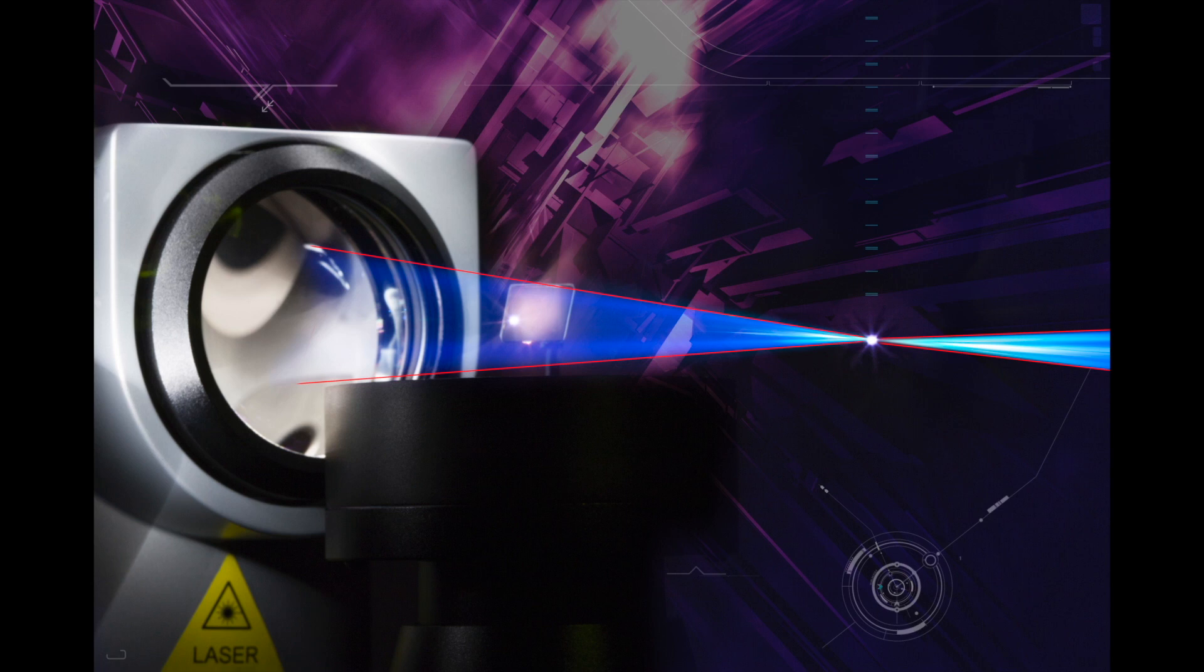A YAG contact lens increases this convergence angle to 24 degrees. On the one hand, they serve to stabilize the eye, and on the other, they have the function of a burning glass to further increase the energy density in the laser focus to achieve plasma formation.